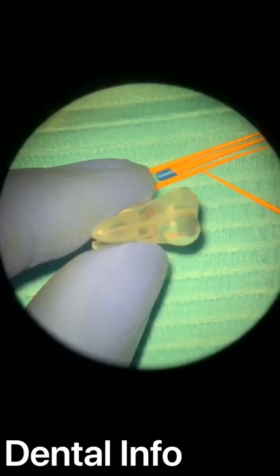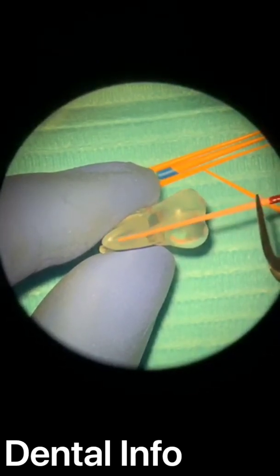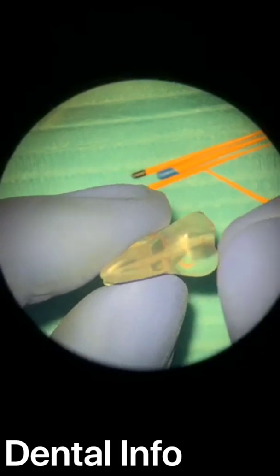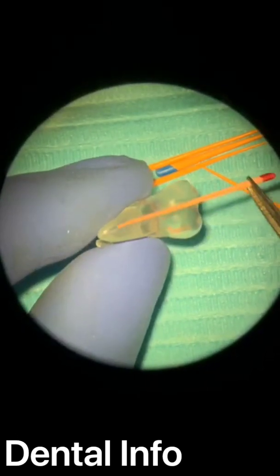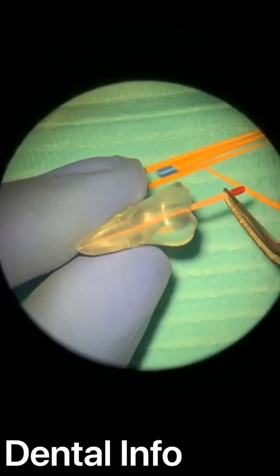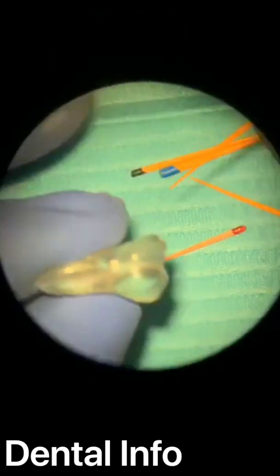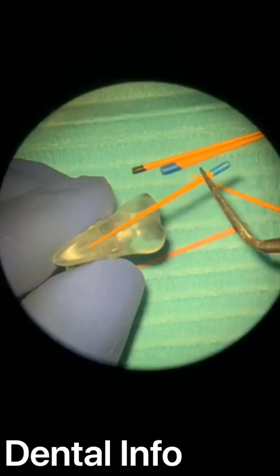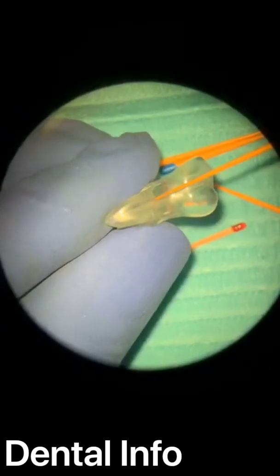So your gutta percha cone will not go so far from the apex. As you see here, when I prepared this tooth for you, I respected my last file, so I am just kissing the apex and saying bye-bye. Do not over-prepare your apex. So the 2504 has no tugback at all. I will remove it. You will not do that always in your cases, but it's good to understand what's happening here.